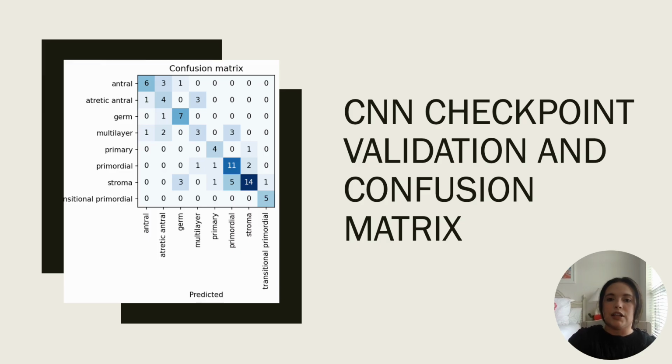Our model achieved a validation error of 26.2% and a test error of 32.1%, which again aligns with this moderate performance and highlights some important limitations. The increase from validation to test error indicates that the model may not generalize perfectly to new unseen data. This could likely be due to variability in staining, tissue structure, the limited tile volume within the trained CNN folders, or class imbalance.